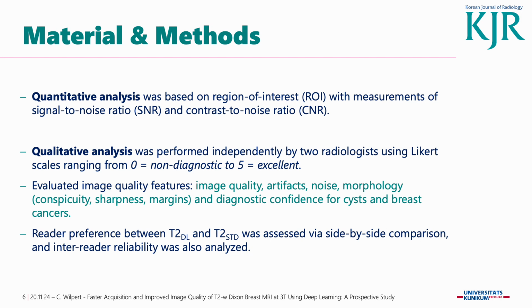We evaluated image quality features such as image quality, artifacts, noise, morphology containing conspicuity, sharpness and margins, and diagnostic confidence for cysts and breast cancers. We also evaluated the readers' preferences for the two sequences in side-by-side comparisons, and inter-reader reliability was also analyzed.